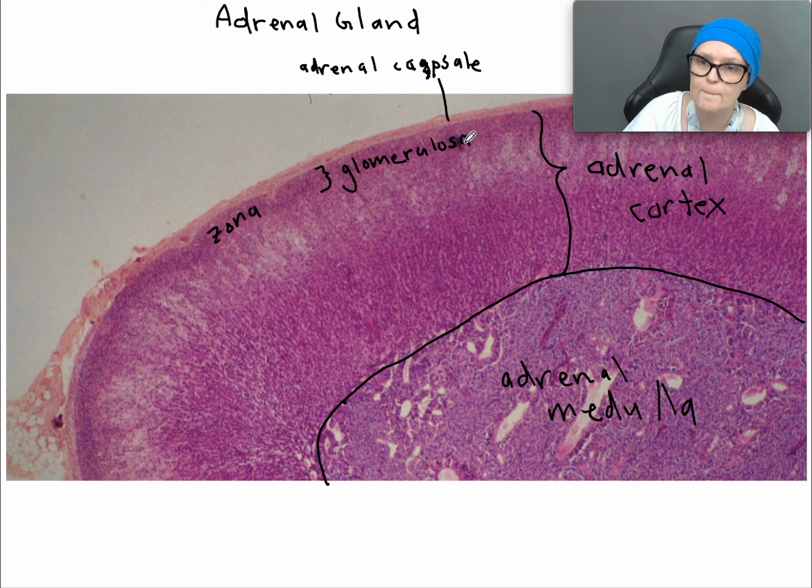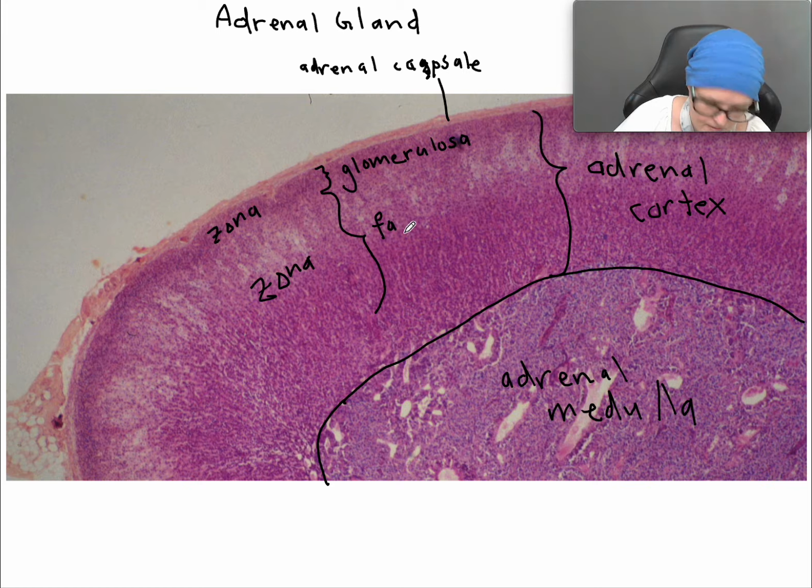Did I spell it right? That's true. Yeah. And then the next, like the majority of the gland, is the zona fasciculata. Fasciculata, S-C-I-C-U-lata.